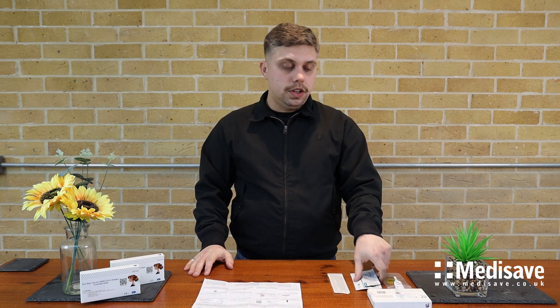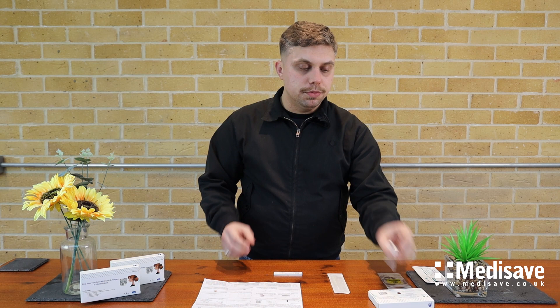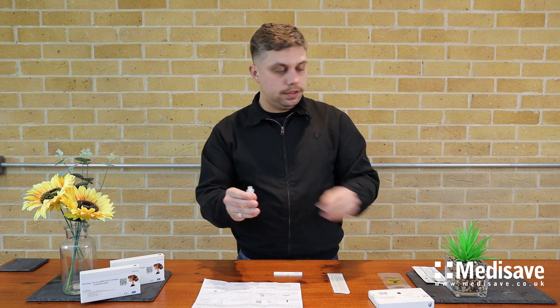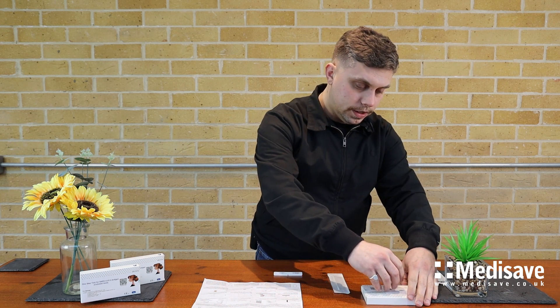Now we're going to take the test, so I'm going to remove the test cassette from the safety packaging and place that on the table. Now I'm going to remove the safety latch from the extraction tube and put that in the handy holder, and now it's time to take the nasal swab.